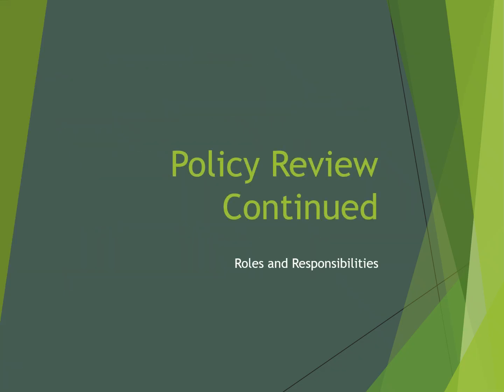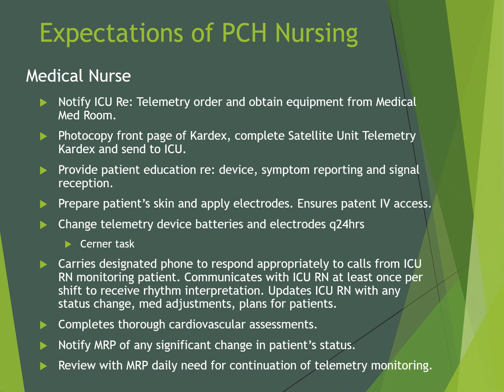This section of the presentation will include a review of the roles and responsibilities. As the medical nurse or the primary nurse for the med-tele patient, the expectation is that when a satellite telemetry monitoring order is given by the MRP, we notify the ICU regarding the order and obtain the equipment from the medical med room. We will photocopy the front page of our Cardex and complete the satellite unit telemetry Cardex and send both documents to ICU.